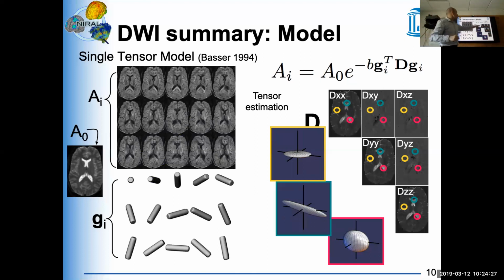And then you have areas where we have crossing fibers, so where our assumption of a single Gaussian distribution breaks apart. Now we have 2 fiber bundles. What you can see there is that, in this particular case, you have 2 major fiber bundles. You get this more flat disk where lambda 1 and lambda 2 are relatively high. That's because we have 2 fiber bundles, and it's in that plane of the 2 fiber bundles where this disk is. And in the plane out of the 2 fibers, that's where you would still have a low value.